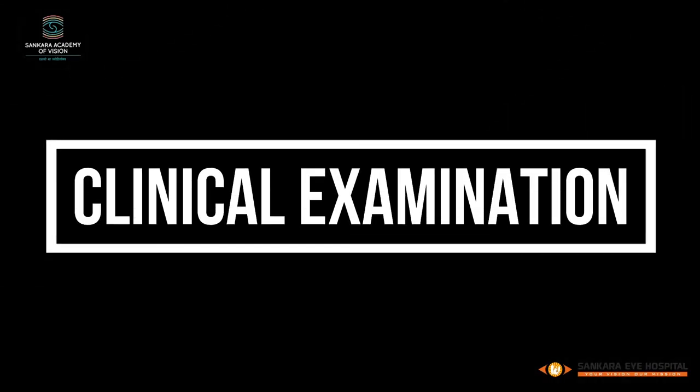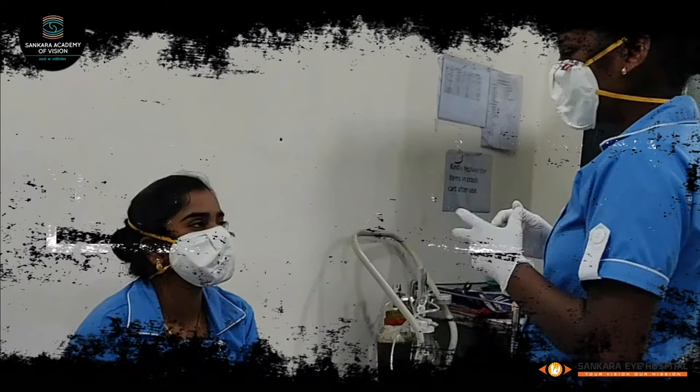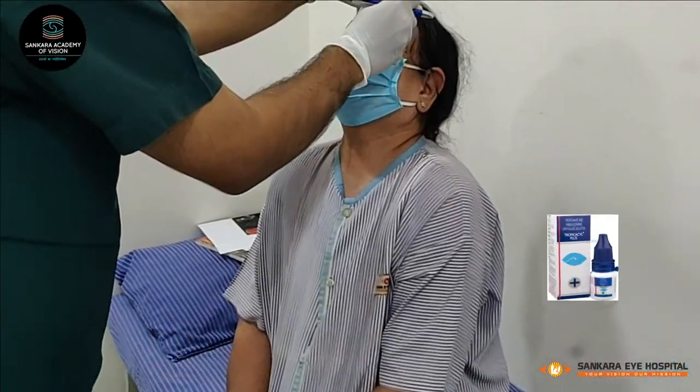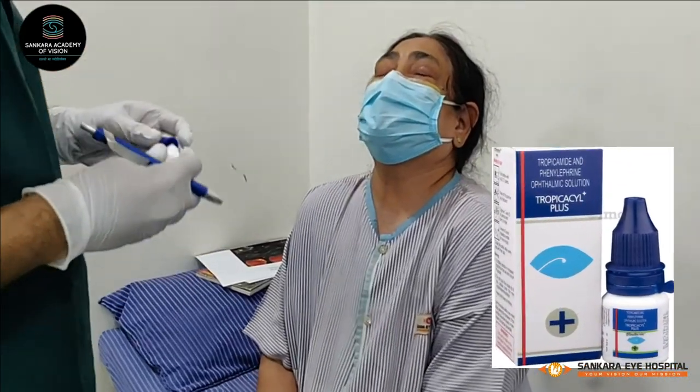Now, as we are familiarized with the instrument, let's start with the clinical examination. First, explain the procedure to the patient. Dilate the pupil well with tropicamide and phenylephrine drops.